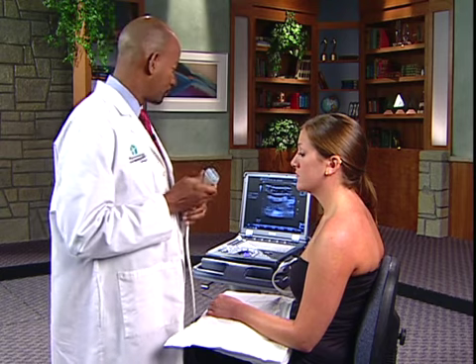Let's now take a look at the glenohumeral complex. The glenohumeral joint is also another critical joint that may be involved in the sites of particularly things like osteoarthritis and other types of arthritis.